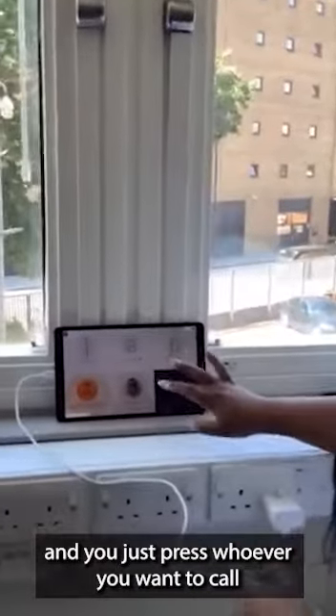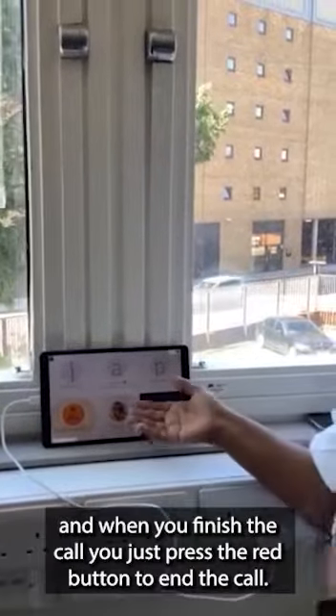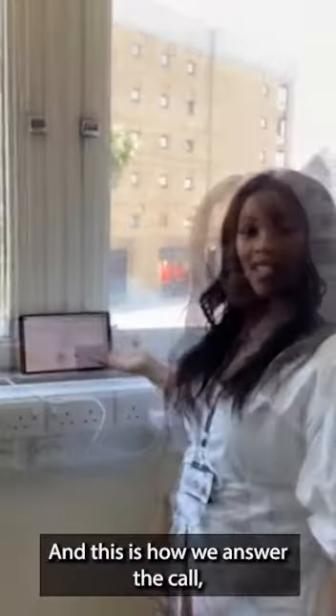You just press whoever you want to call and the call will go directly through to them. When you finish the call, you just press the red button again to end it. And this is how we answer the call.